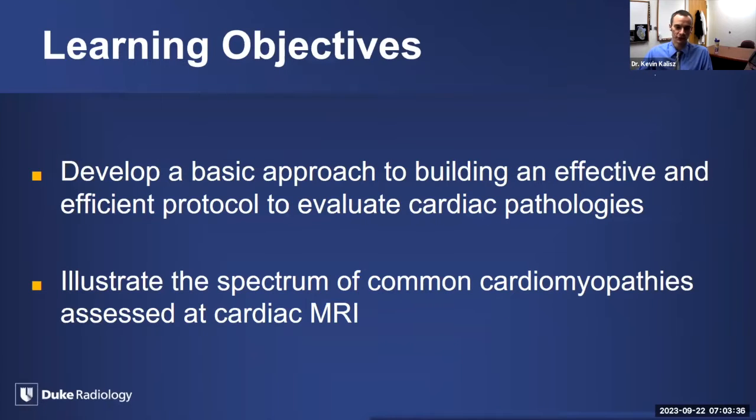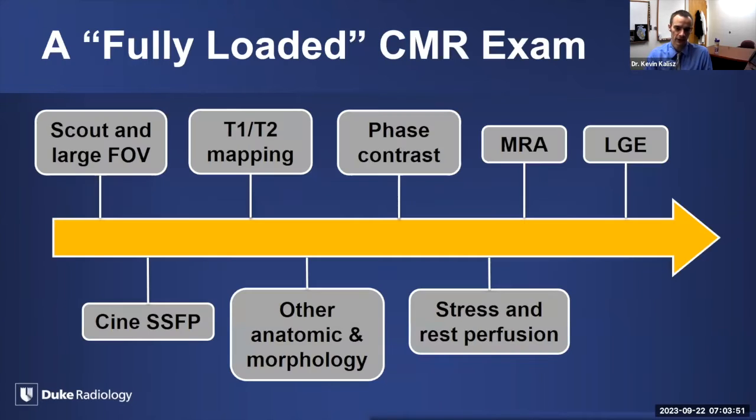Formally, what we'll do today is develop a basic approach to building an effective and efficient protocol to evaluate cardiac pathologies. And again, really the focus here is to illustrate the spectrum of commonly seen or commonly tested-for cardiomyopathies that we typically see at cardiac MRI.